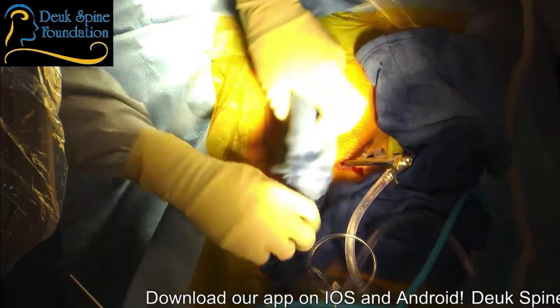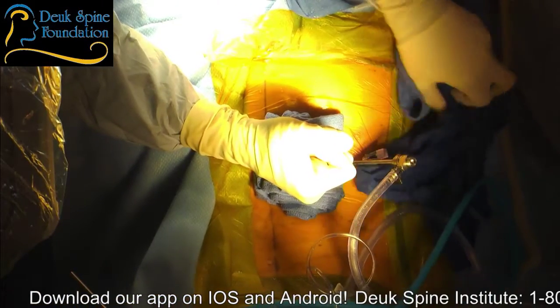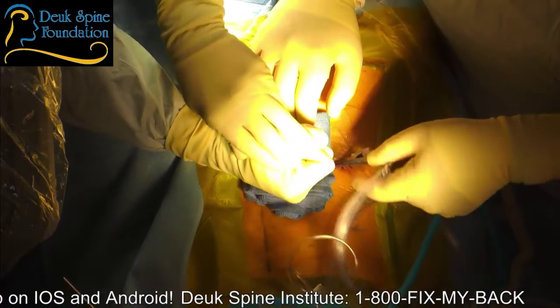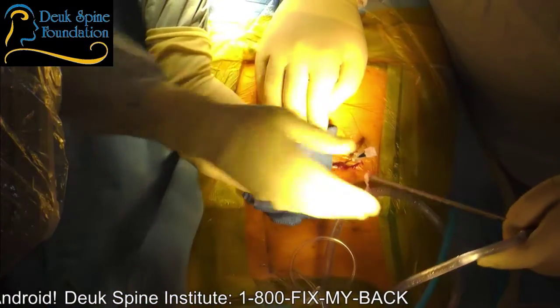Alrighty, so we've done the second disc at L45. We're getting ready to get into the third disc, which is actually the top one, and that is going to be the L34 disc. We've already done two. We did the L5S1, the L45, and now we're going to do the L34.